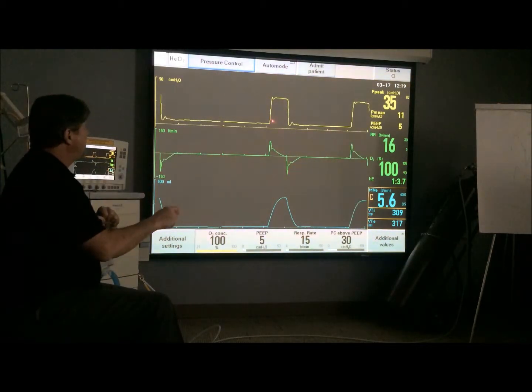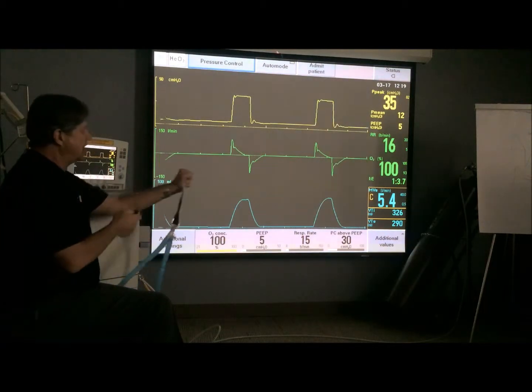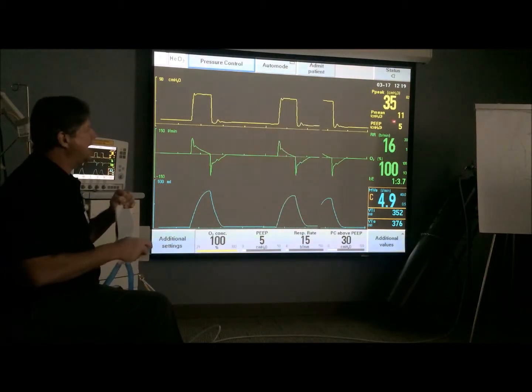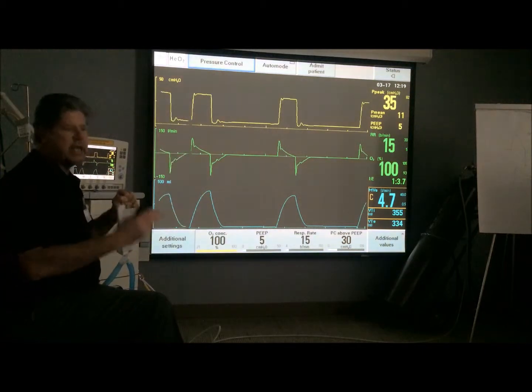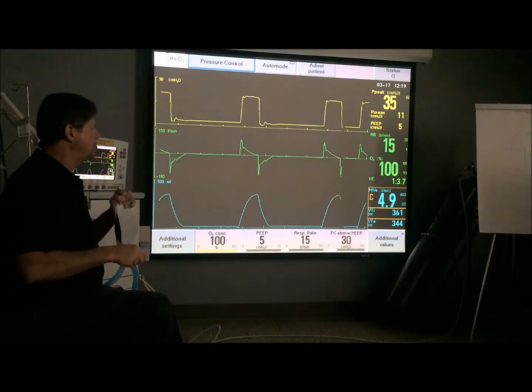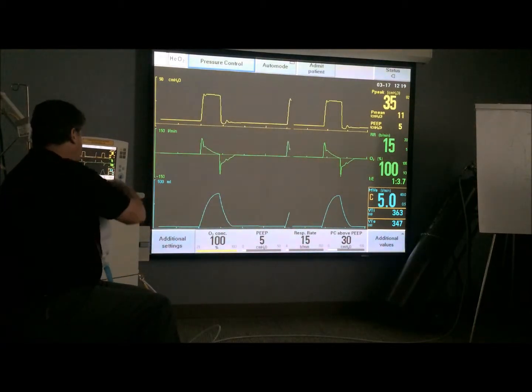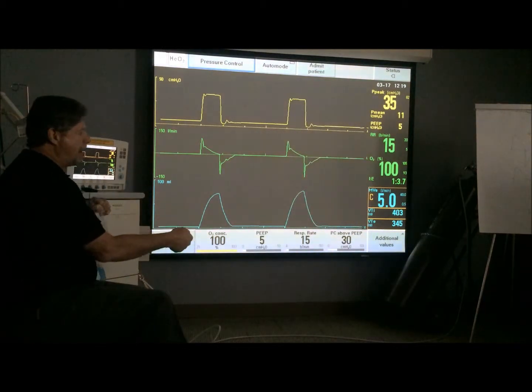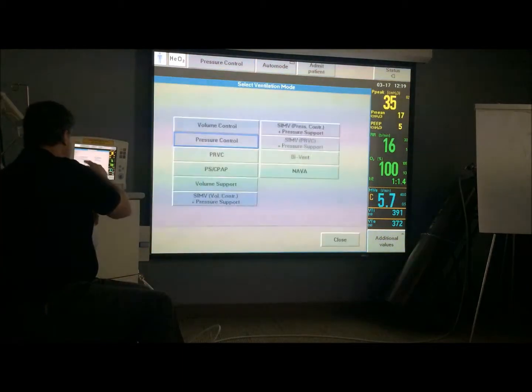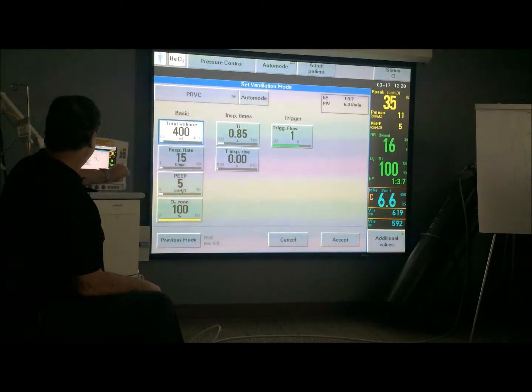The ventilator is still doing the best it can at delivering the volume that you want, in this case, let's say 400 cc's, but we just can't do it because the lung has become so non-compliant that I can't deliver the 400 cc's. So our option now is letting the doctor know that he could ask us or order us to increase the pressure higher so that we maintain normal CO2, or we can say we're going to tolerate a higher CO2 and protect the lung by not going any higher than a pressure of 35. So in pressure control, it's up to us then to stop turning the pressure knob at a certain point in time, and the ventilator can still deliver that volume. In PRVC, since now we've given control up, in essence, to the ventilator, to deliver that volume.